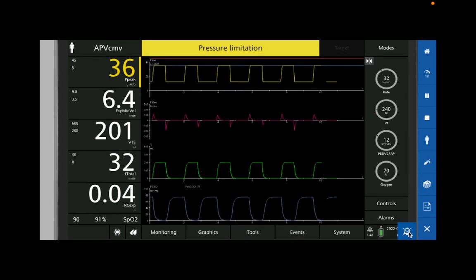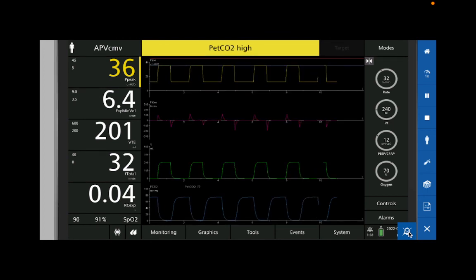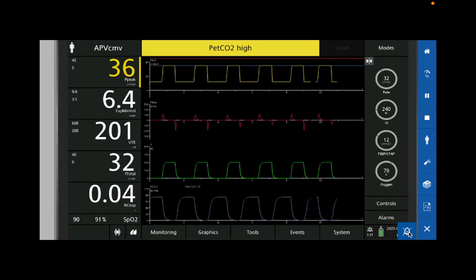So if you're having blood pressure issues and oxygenation issues, you have to work on fixing them both. It might mean putting them on 100% while you quickly get the blood pressure issues under control, hopefully. And then saying, I don't want to leave this patient. Even then you might say, oh good, my sats are 93, my blood pressure is 100 systolic, now I can go home. No, at this point you should say I should probably increase my PEEP.